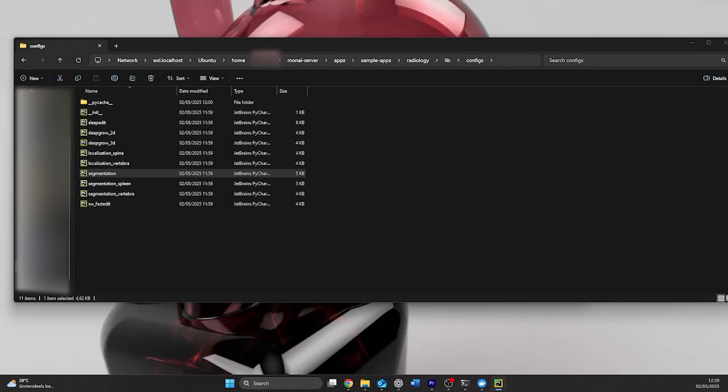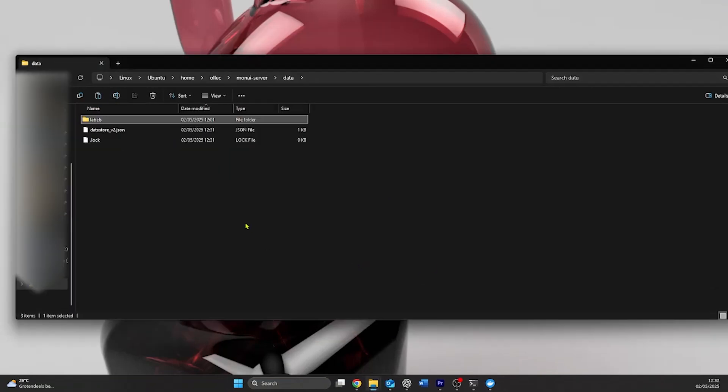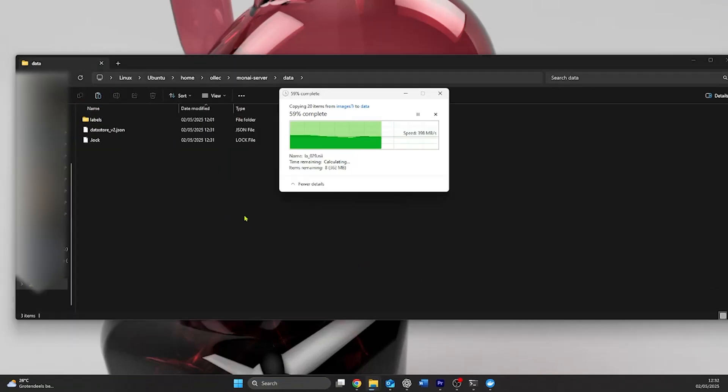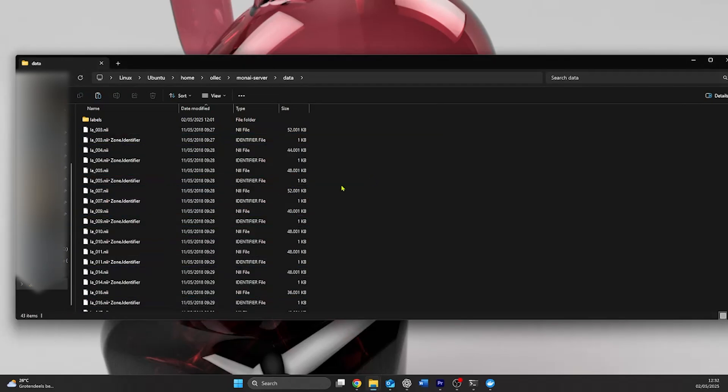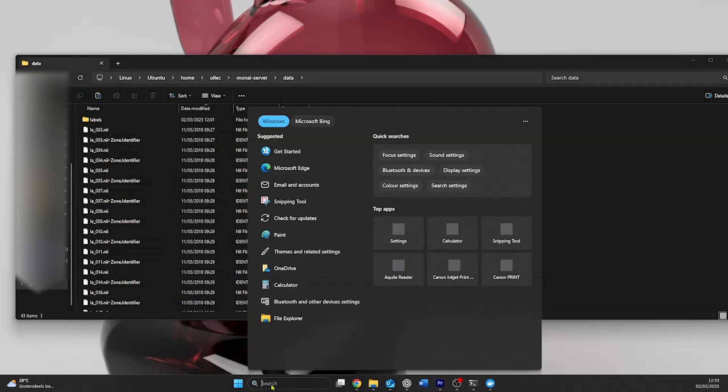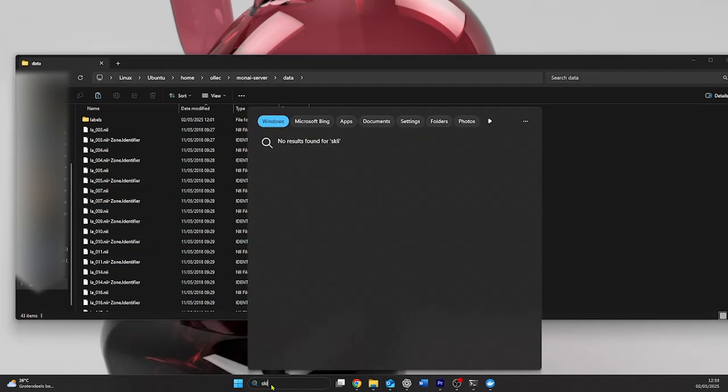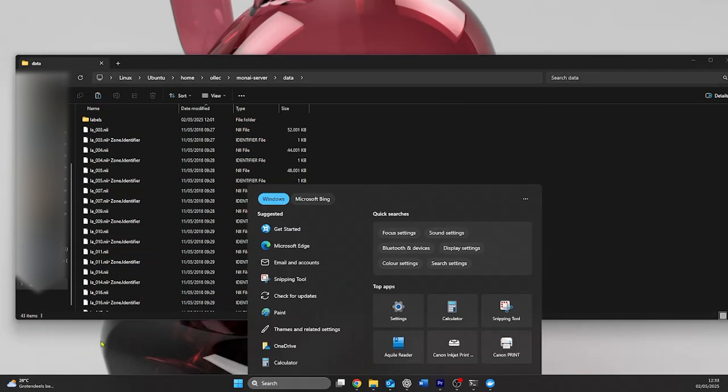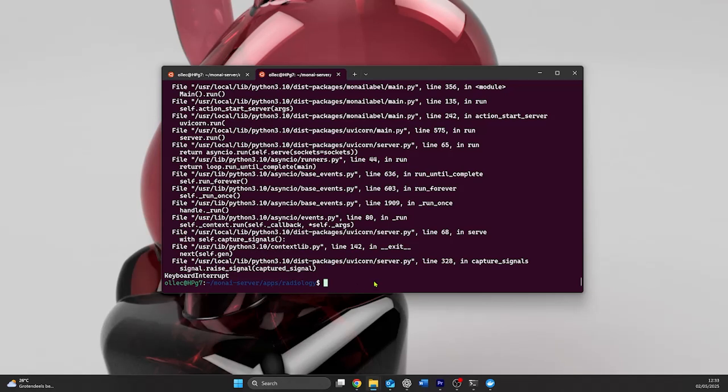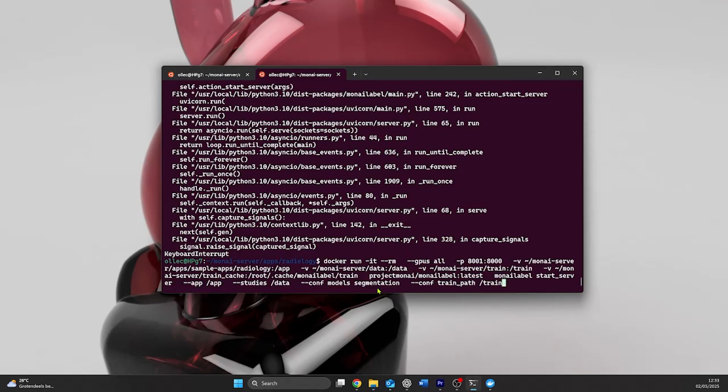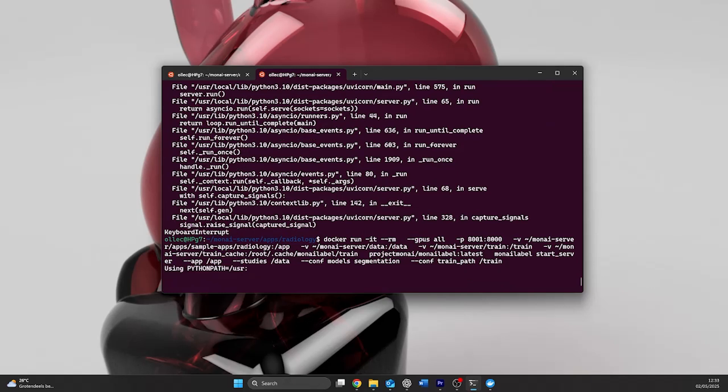After adjusting our configuration, we can get our data ready. We put the data that we have collected in the Moni server data folder. I use the .nii files from the folder that I previously downloaded. After we put our data in place, we run our code to start the server. The server then takes a second to start, and once it's started, we can open slicer.